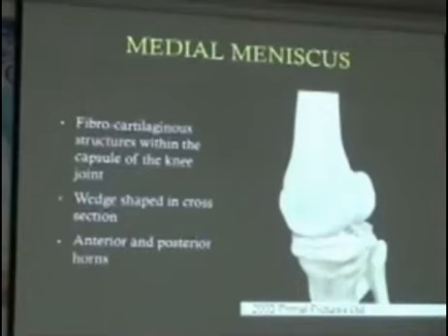And with the ultrasound, it is a wedge shape, so it's much broader on the lateral aspect than what it is on the inside.